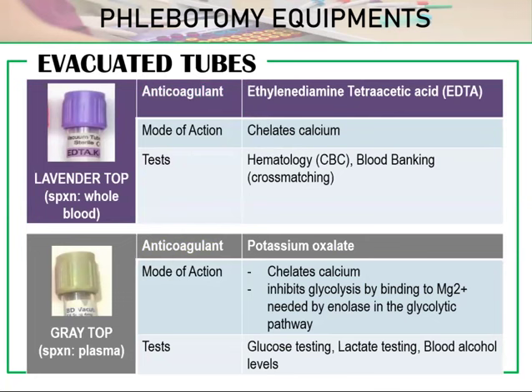Usually sa inyo kay naka-glass man. If you can observe, it is in liquid form. But for the plastic, it is spray dried. Wala siyang particles inside, it's not in liquid form. Again, plastic is dipotassium EDTA and spray dried. And for the glass, tripotassium EDTA, in liquid form.